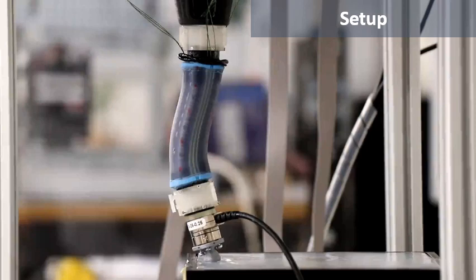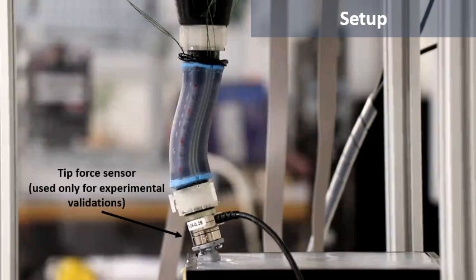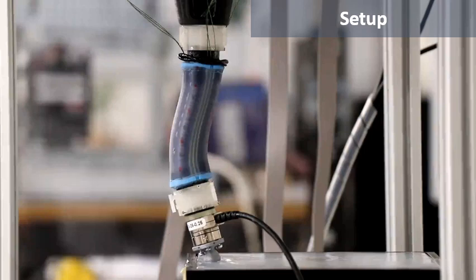Our experimental setup. We use a STIFF-FLOP appendage as a continuum probe. We have a base force sensor, which is used in the simulations, and we have a tip force sensor, which is used only for experimental validation. We have a phantom tissue fixed on a linear actuator in which we embedded a hard nodule, and the slider moves from right to left underneath the appendage.